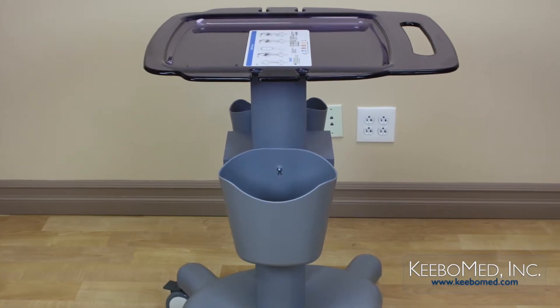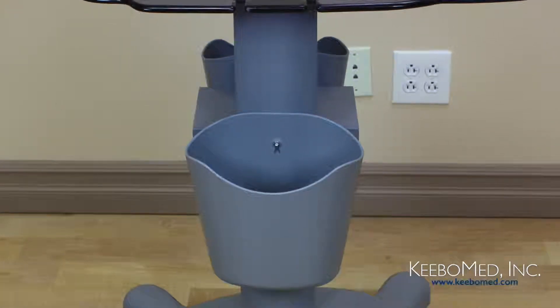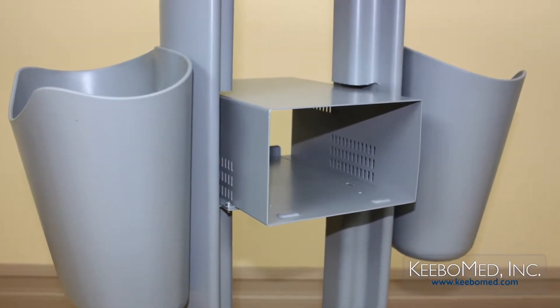On each side of the cart there are two deep storage containers that can also be removed if needed. The center features an enclosed storage shelf for a video printer.